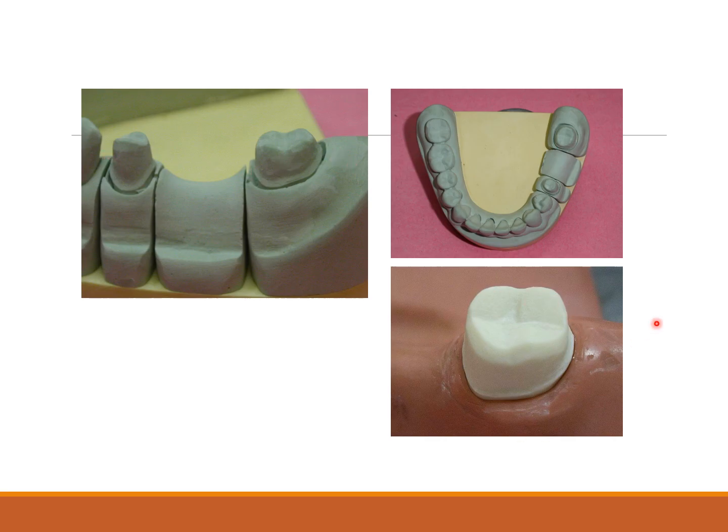This is a single crown, guys. This is a margin. And this is a functional bevel, guys. Can you see? You'll be able to appreciate it on the functional cusp.